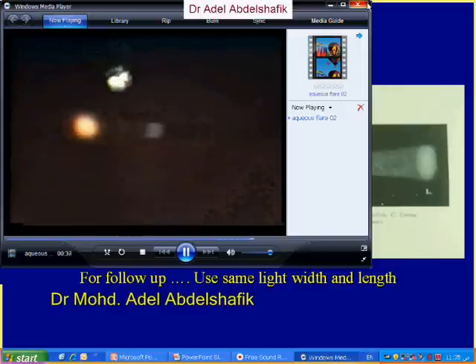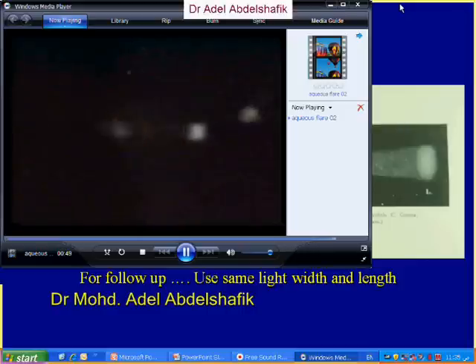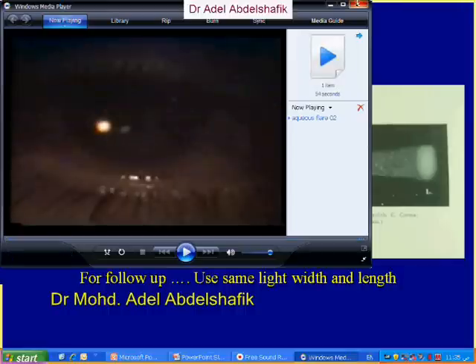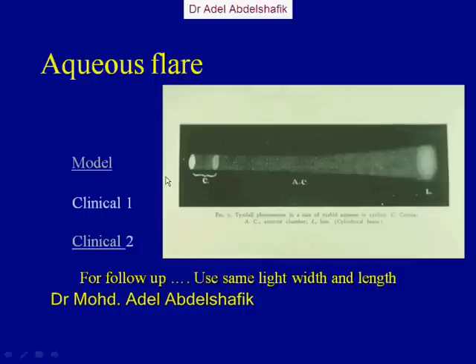This is against the iris, and if you go a little bit up, it will be against the pupillary area. You see, when the light is long, you can see better. If you are following a patient, we have to keep the same width and the same length for follow-up.